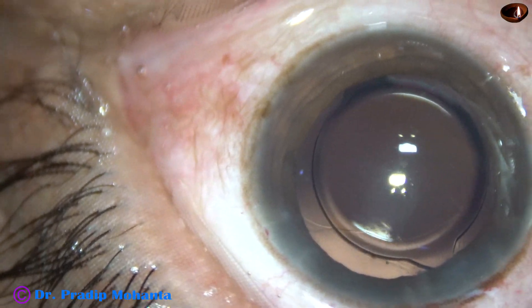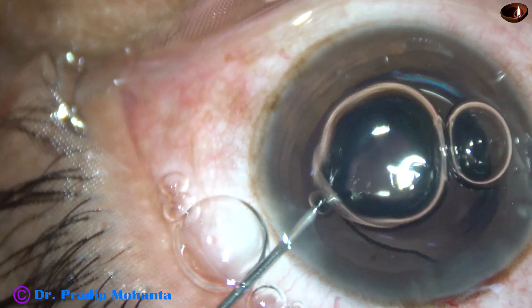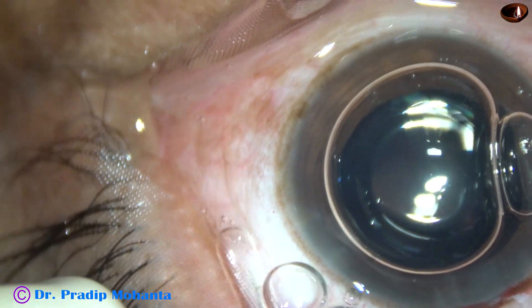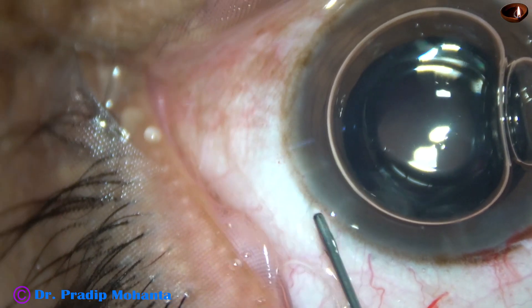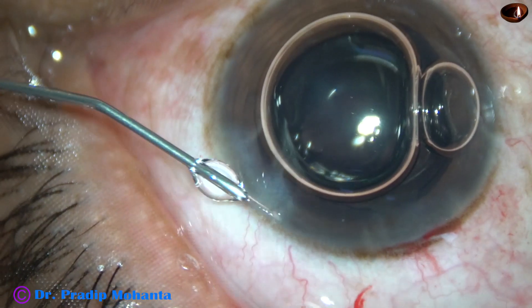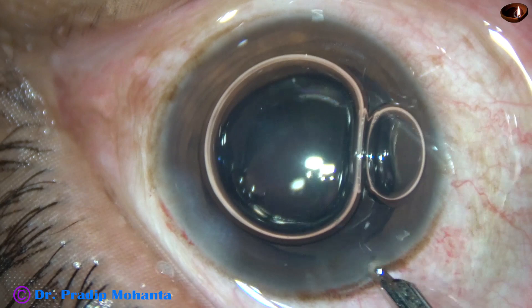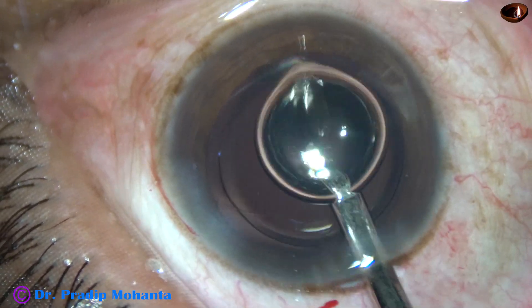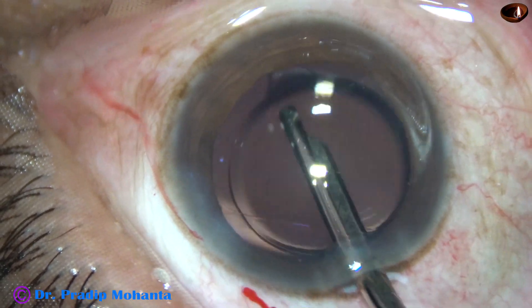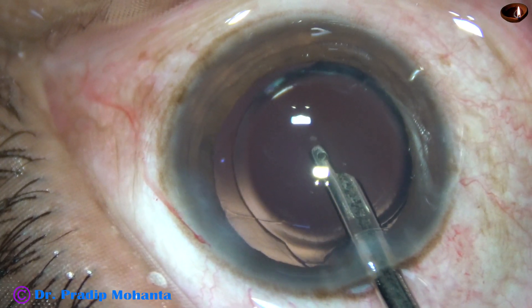Now both the irrigating cannula and aspirating cannula are in the anterior chamber. See the lens — it is very nicely centered. The anterior chamber is shallow at this moment, so I inject an air bubble to maintain the anterior chamber. This is a bit of moxifloxacin. And now the side port is closed by hydrating the corneal stroma on either side of this paracentesis wound. There is only one paracentesis incision in this case. And now a final lavage of the anterior chamber. I find that the haptics have shifted a bit, so I orient the lens and place the haptics about 90 degrees away from the main wound and the weak point.